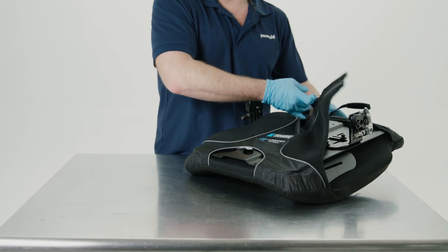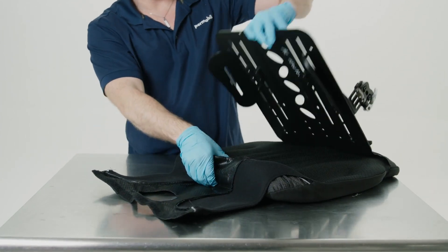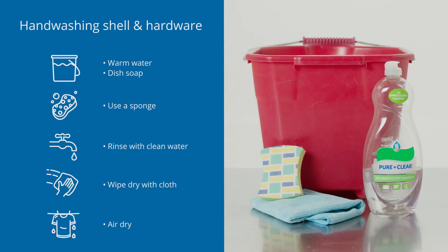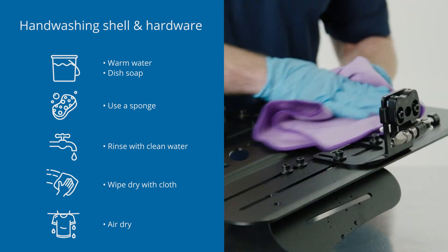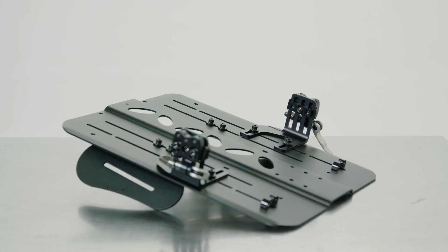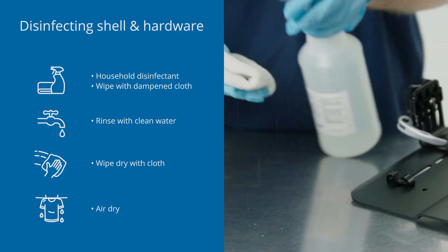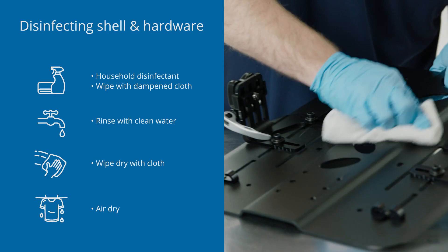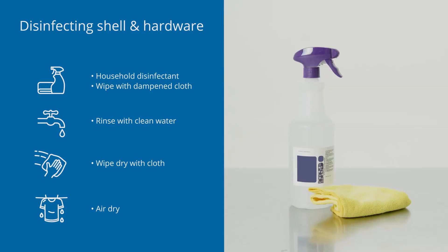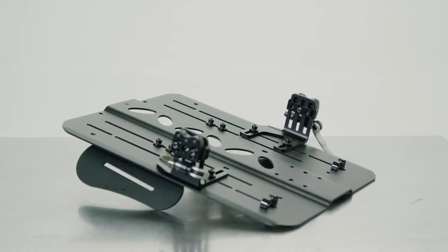For the comfort line of back support, separate the inserts and cover from the back shell. To clean the shell and hardware, hand wash in warm water with soap and a sponge. Rinse with clean water and wipe dry with a clean cloth before allowing it to air dry completely. To disinfect the back shell and hardware after cleaning, wipe gently with a cloth dampened with household disinfectant. Rinse with clean water, wipe dry, and allow to air dry completely.